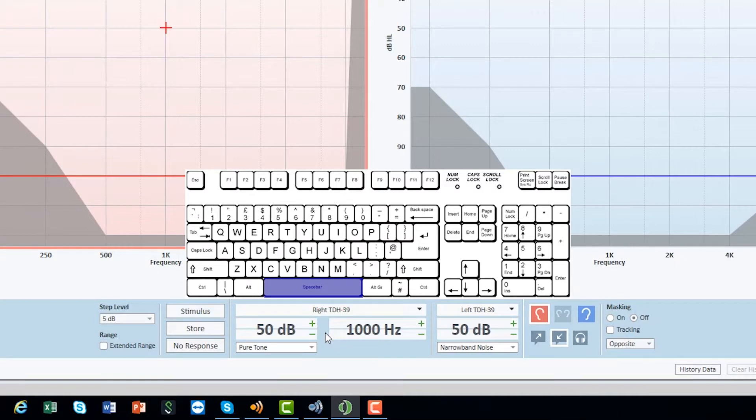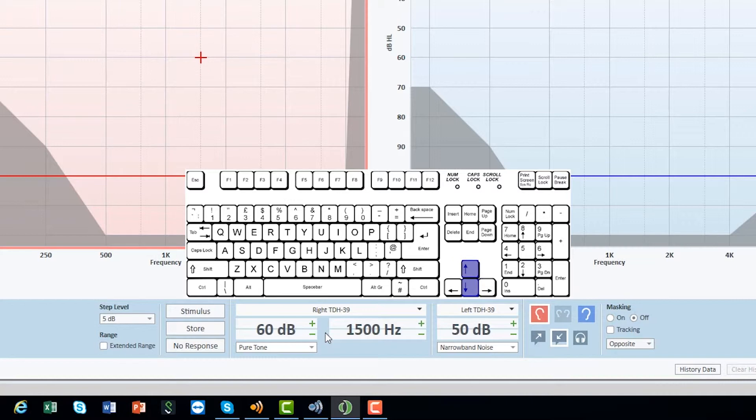To navigate between different frequencies, use the left or right arrow key. To change levels, use up and down arrow keys. To store, use S.